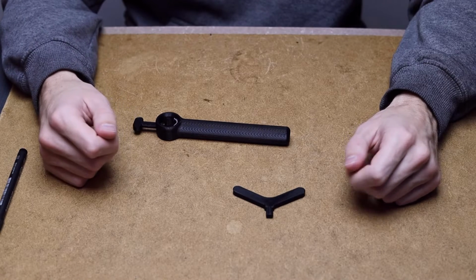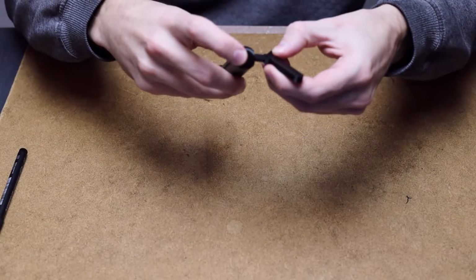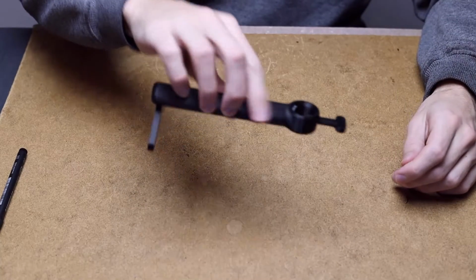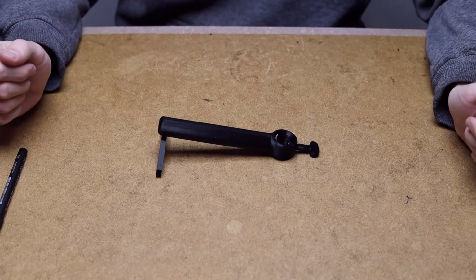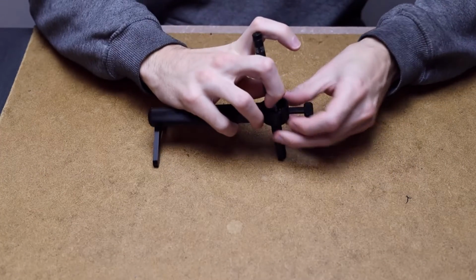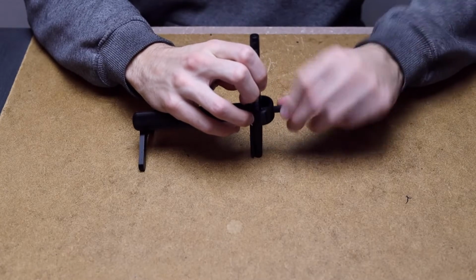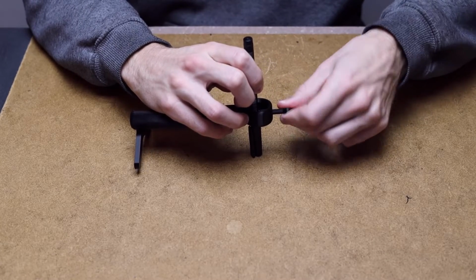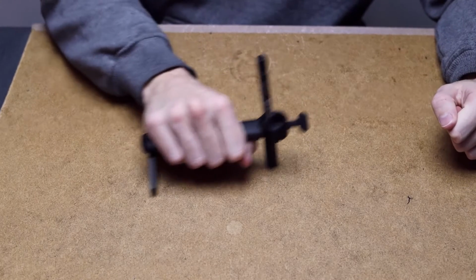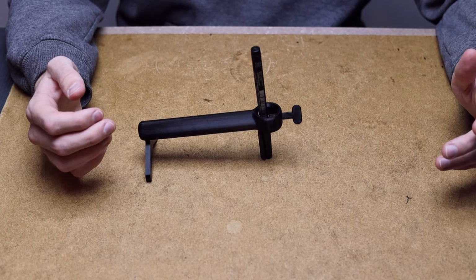Now we will try to mount the support underneath in the hole. Here we simply just screw it in with the thread, like this, and then it works. Now you can test with a pen, insert it into the hole, tighten the screw, just like this. Then you can use it to write if you have less motor skills in your hand. Enjoy!